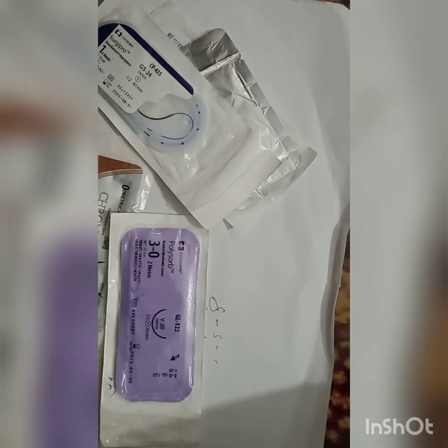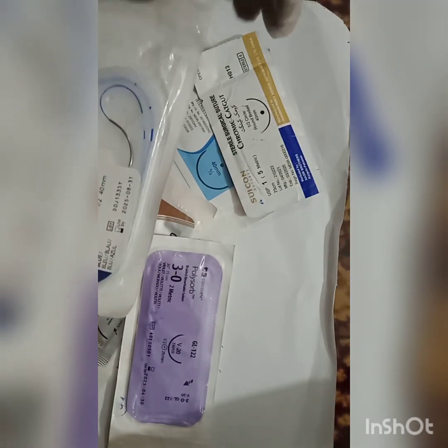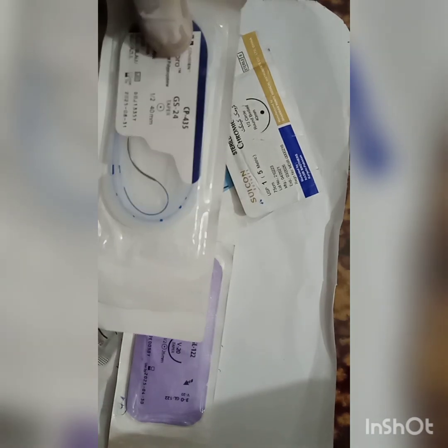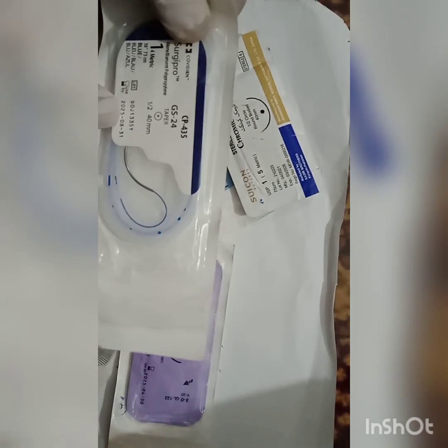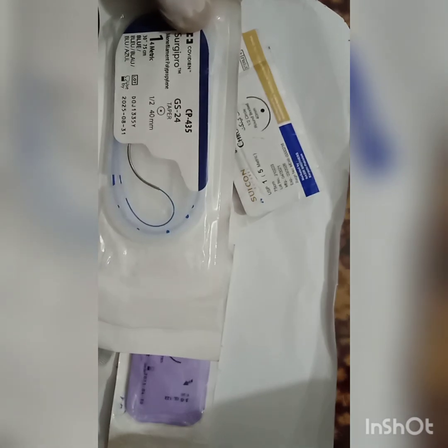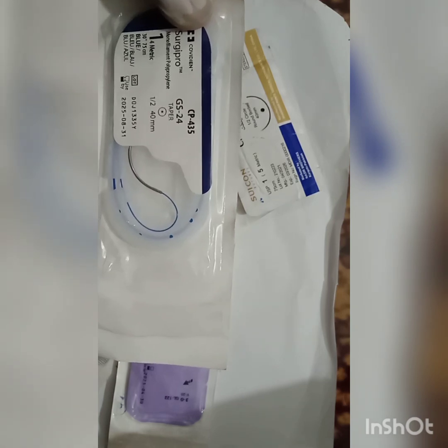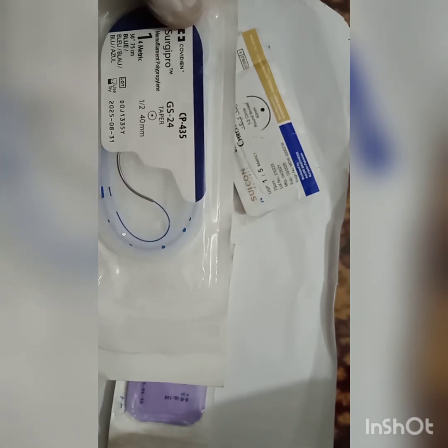So these were some important points you must know about the sutures before choosing any suture for any surgery. So in the last I will briefly tell you which sutures should be used in which surgery. Suppose a propylene or prolene suture is mostly used for the skin closure, for the tendon repair, for the sheaths closure, and especially for the vascular repair.